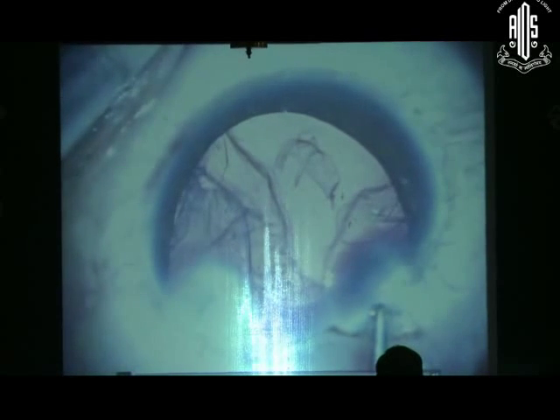I think the problem in this particular case was overconfidence. Because if you could see the turbulence in the anterior chamber, the parameters were pretty high. And that is why you had a sudden surge and the capsule just got ruptured. Had the parameters been set lower, you would possibly not have ended up in this situation.